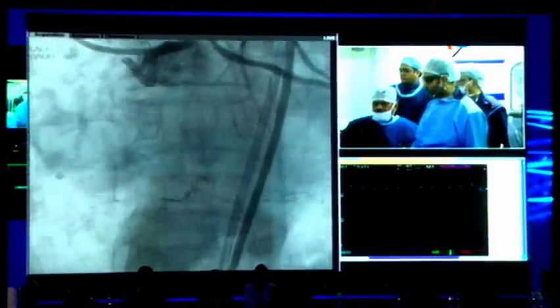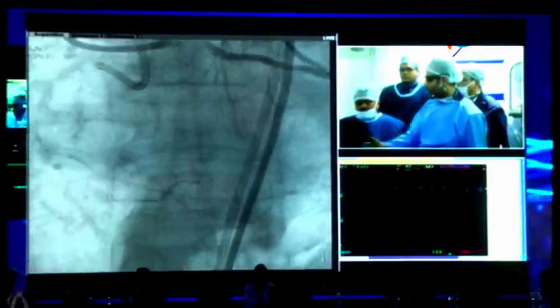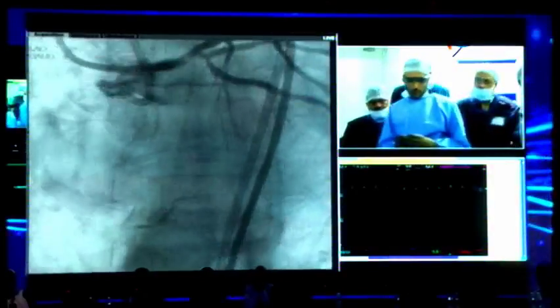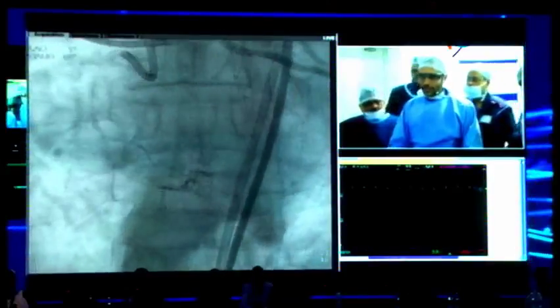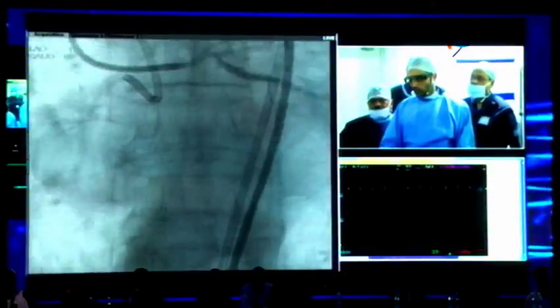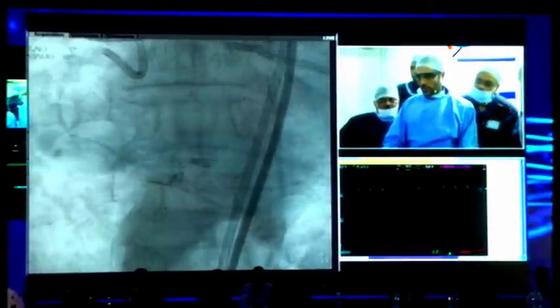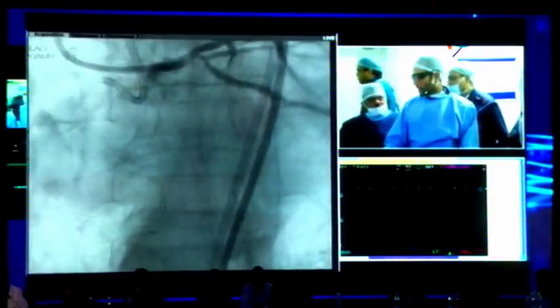Can you use a Fielder FC? It really doesn't have any penetration, so no. What about XTA? Would you like to use a Fielder FC in place of the Pilot? FC doesn't do a great job. I've tried it once or twice and it usually just ends up buckling. I need a little bit more oomph. What about Miracle 12? No, I might stick and drive it, which is really suboptimal. I might use an XTA.